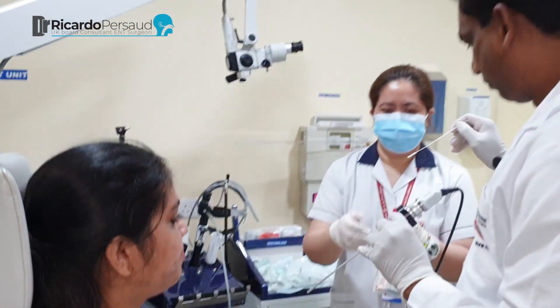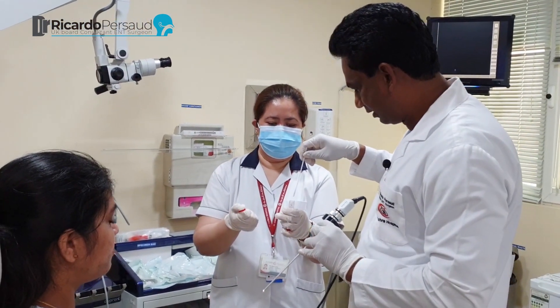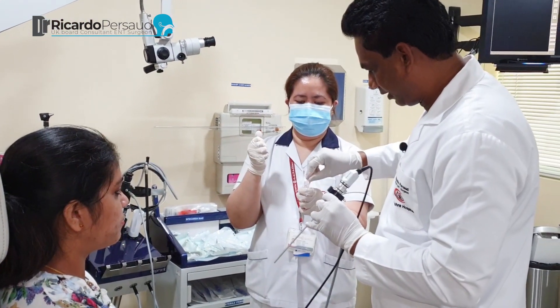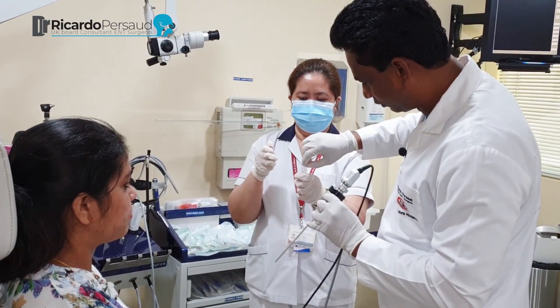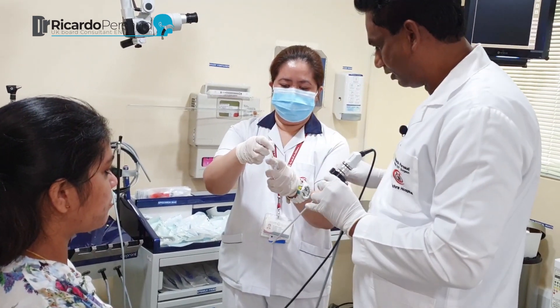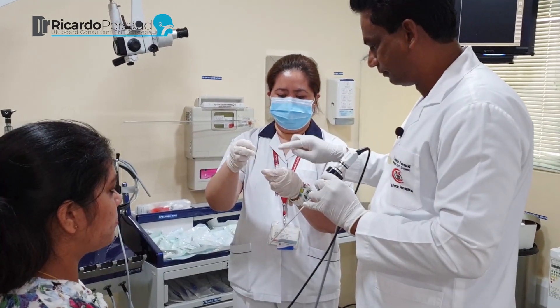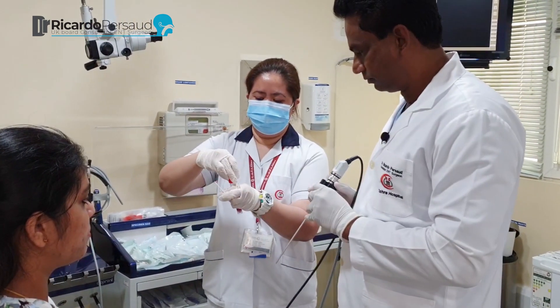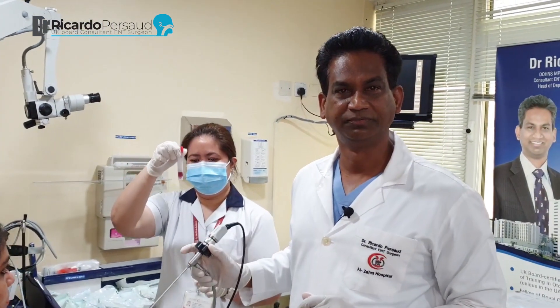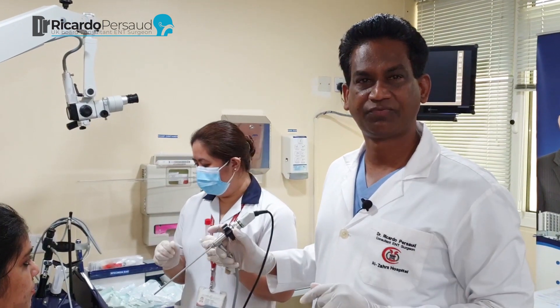So then you open the bottle, put the swab directly in, and then you break it — there's a mark here for you to break. And then you cover it. And that's the proper way to take a COVID swab: first the tonsil area, and then the nasal pharynx.